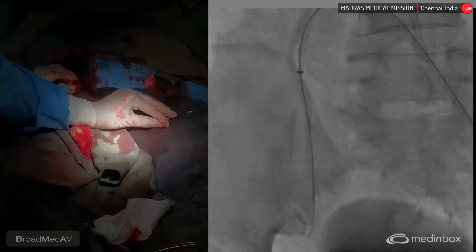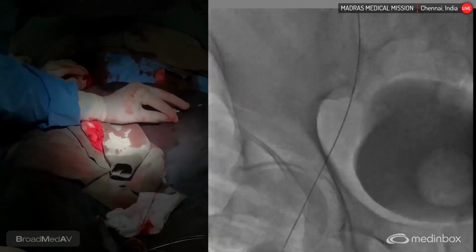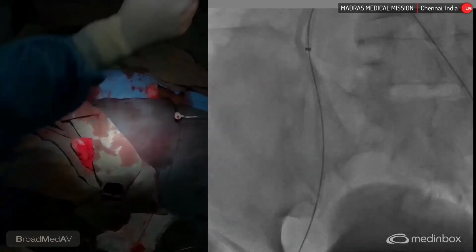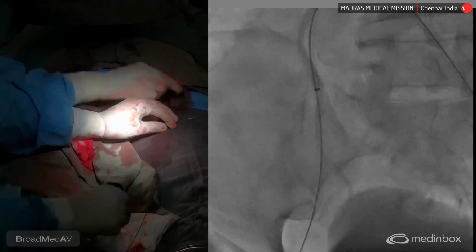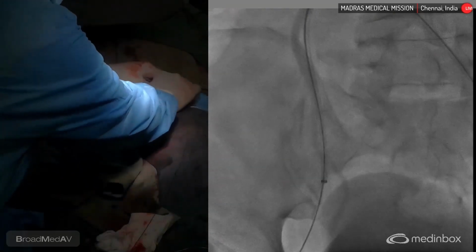Yeah, show down. Pass the wire, go beyond the femoral. Now show above. No, first fluoro, please. Push the crossover maximum to get control. Yeah, okay, right.